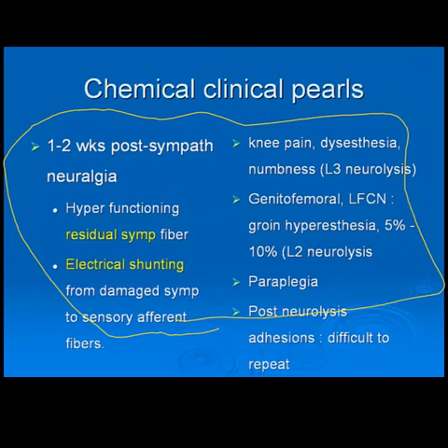As we have mentioned, when you put the contrast, you make sure that nothing is spreading backward to the intervertebral foramen. Despite the fact that we are in front of the psoas and at the anterolateral aspect of the vertebral body, sometimes this might happen. So make sure that your contrast is not flowing back to the intervertebral foramen, as your neurolytic can lead to a paraplegia.